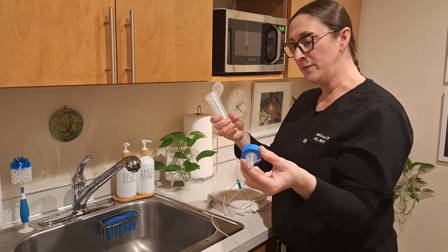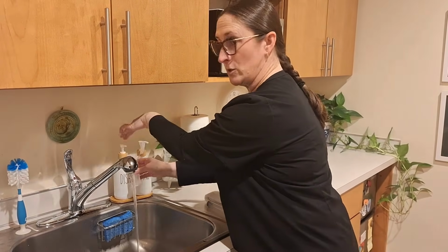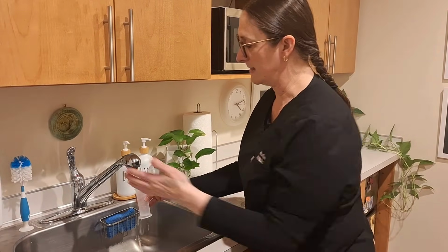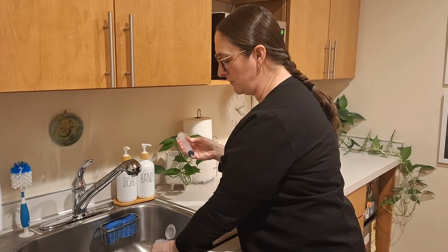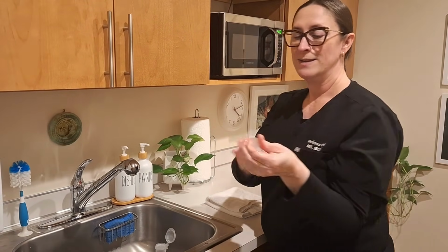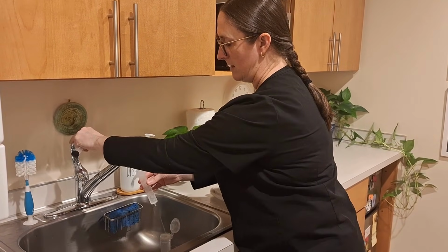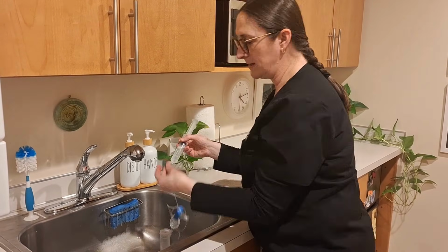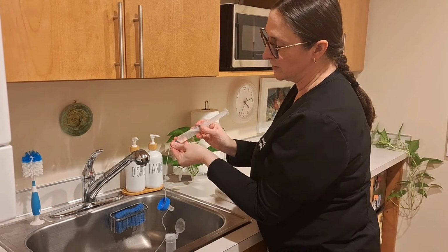Say we've completed a feeding, we can definitely take hot soapy water, a little bit of soap, whatever you're using to wash bottles, pump parts, things like that. What I typically will say, we can wash the container out. To flush the tube, I do find a syringe works best. So I just say, open it up. You can fill it with hot soapy water. And then we find the end of the tube, the part that was sunk into the milk. We just pair that.